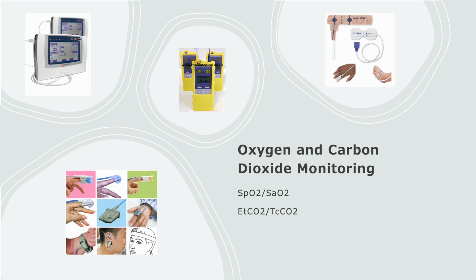The capnography cannula will sometimes have a little mouthpiece that hangs in front of the mouth to pick up oral breaths. End tidal capnography might be abbreviated ETCO2. On the other hand, you can have a transcutaneous capnograph, which uses a heated sensor that uses adhesive and sticks to the patient's skin.